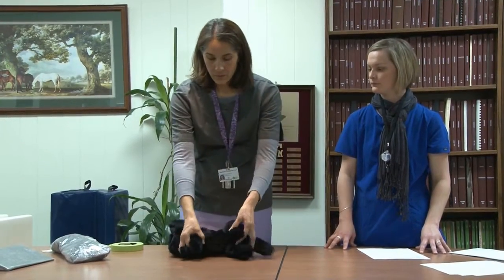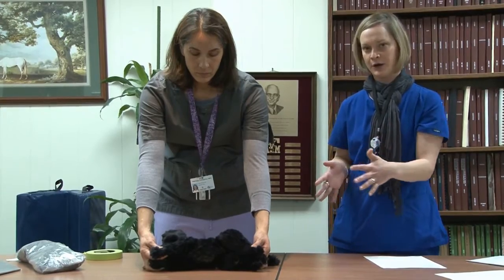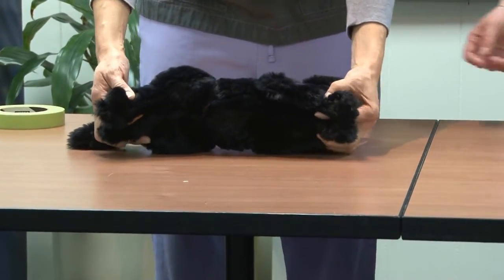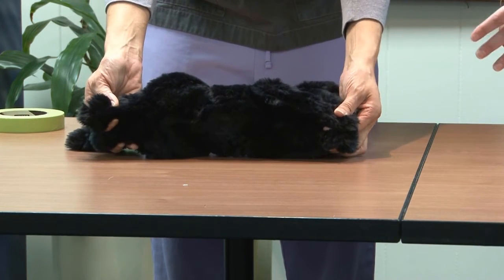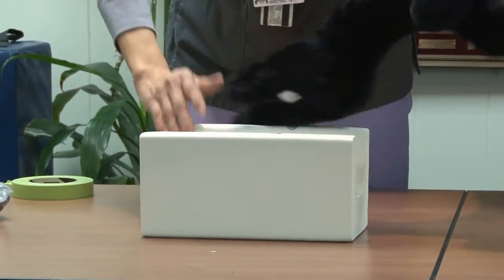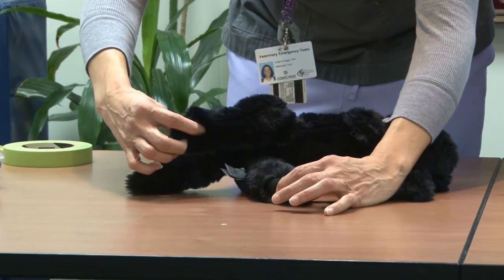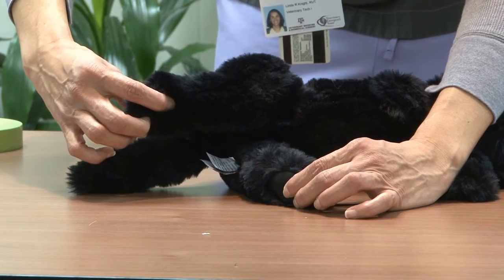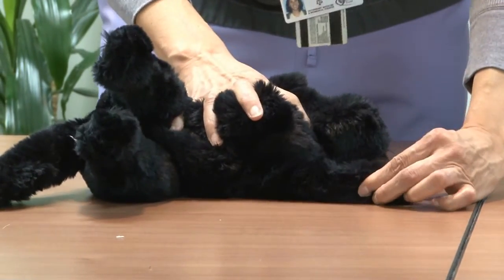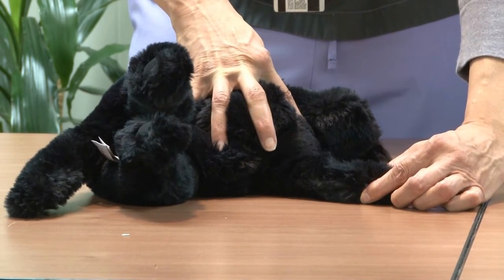Here we show left lateral recumbency so you can visualize how these are taken. Front legs are pulled cranially and back legs pulled as far caudally as possible. We can also do the VD views with legs pulled cranially and caudally. For left lateral pelvis, the bottom left leg is pulled forward and the right leg is pulled back out of the way. For the left forelimb radiograph, the front leg being imaged is pulled out, the top leg is pulled back out of the way, and the head is pulled back out of the way as well.